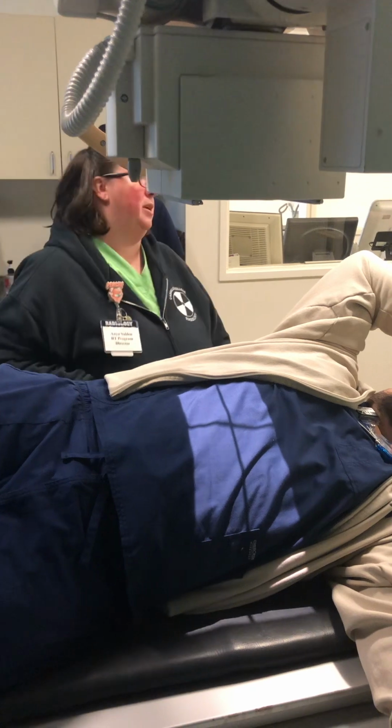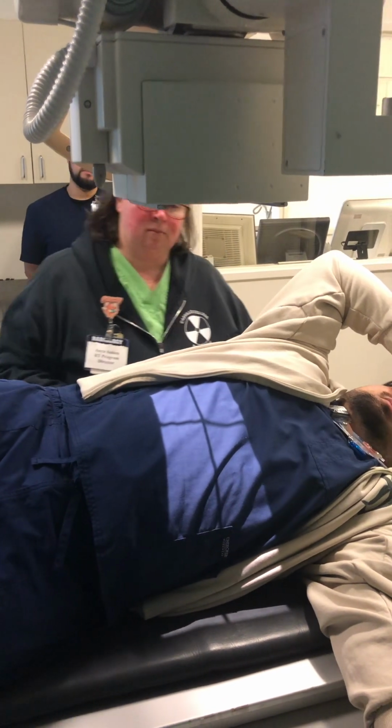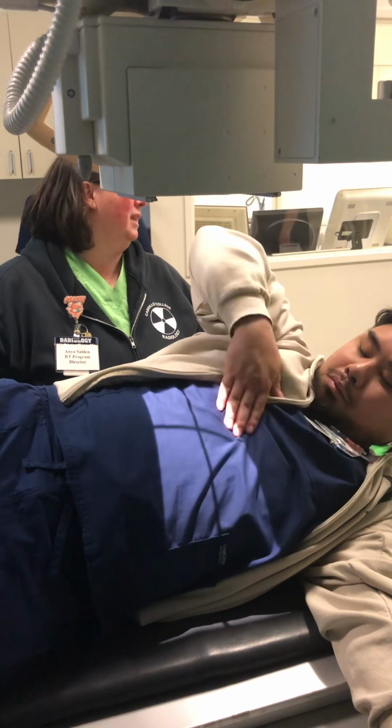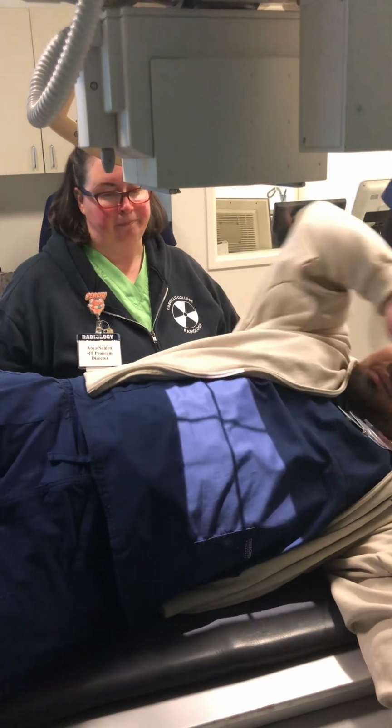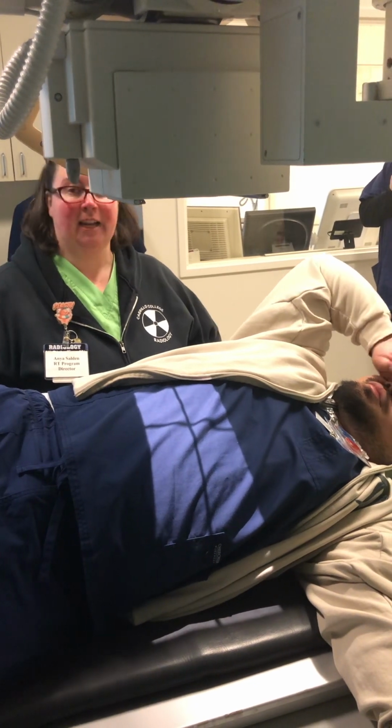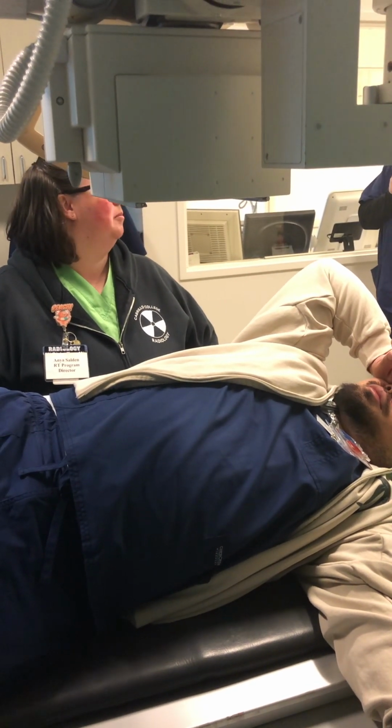And again, deep breath in, blow all the way out. And that would be my oblique for the left lower posterior rib. That's it? And that's it. Yeah. It seems like a lot, but it's really not that bad.